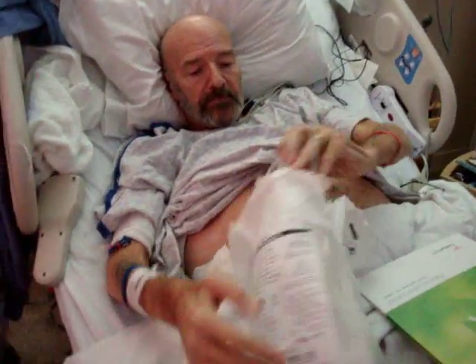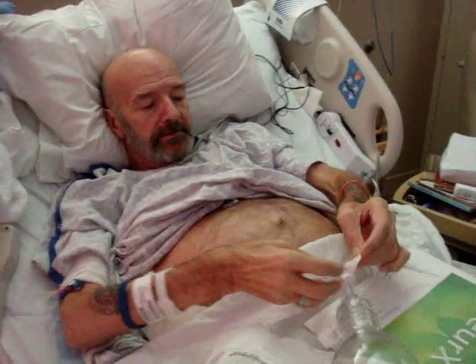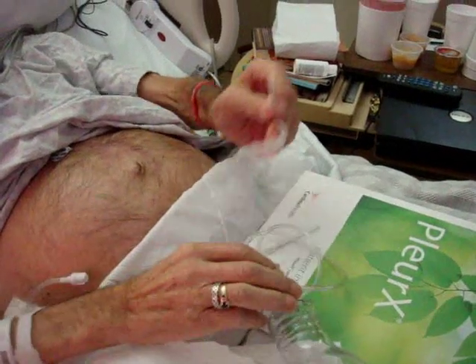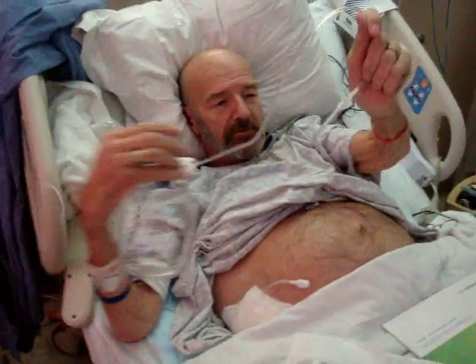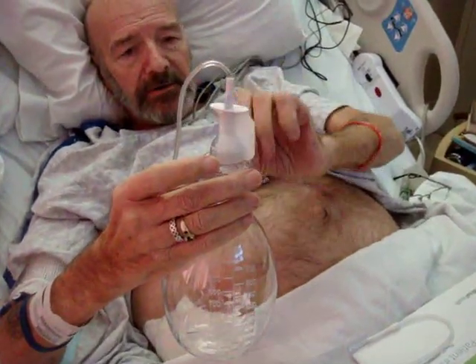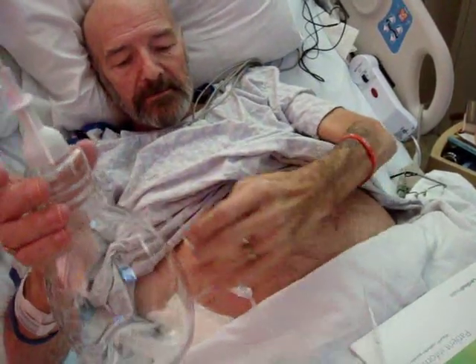I'm taking out the vacuum bottle and taking off this tape that's on everything, so that I can unravel the kit. This is the bottle, and that's a very careful point there that must be sanitised. The sleeve must not have come off. And this part stops the plunger, because once you plunge in, the vacuum goes to work.